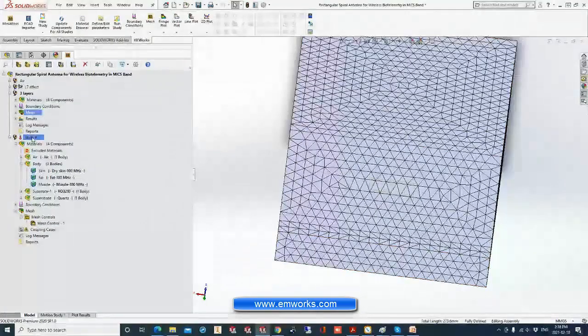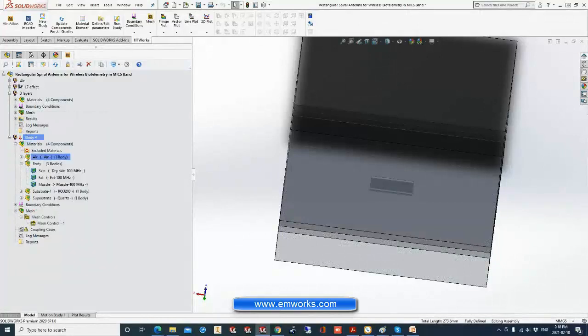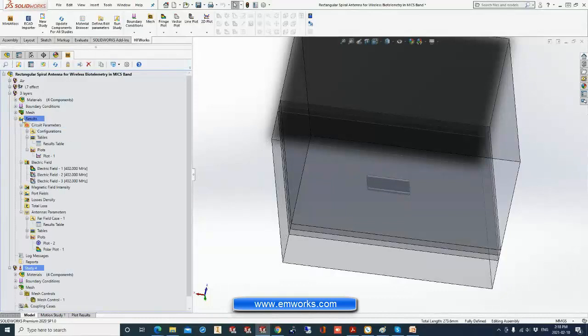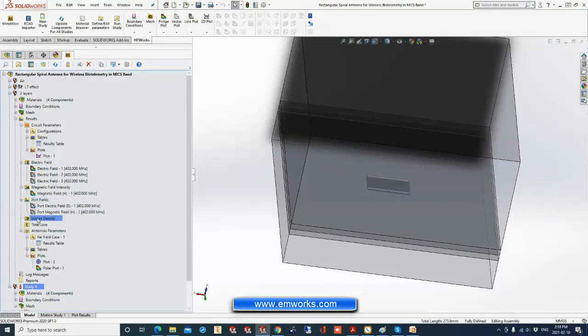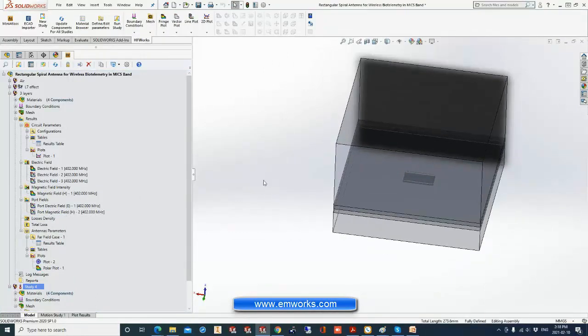After this, you just hit run to solve the problem. Once it is done, it is fast, it takes just 1 minute to simulate this example. When it is done, the software will create a results folder. The results folder contains numerical values of the circuit parameters, output parameters, and we can also make a 3D plot of any other quantity, such as the electric field, the magnetic field, the port field, or the losses related to any body with a certain lossy material.